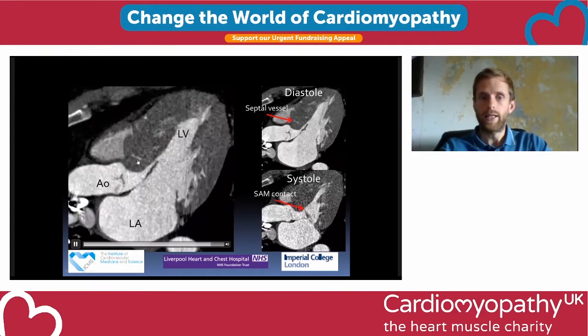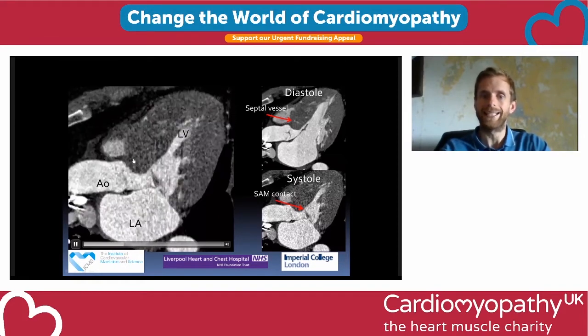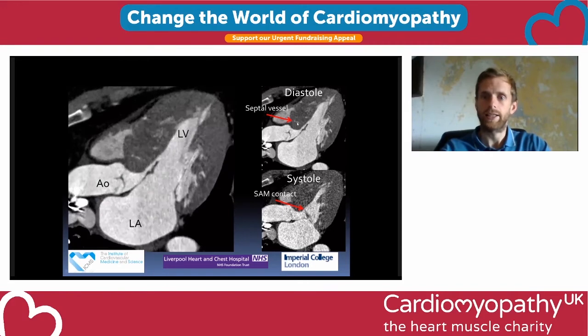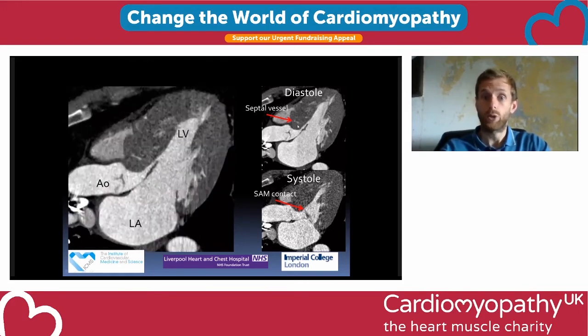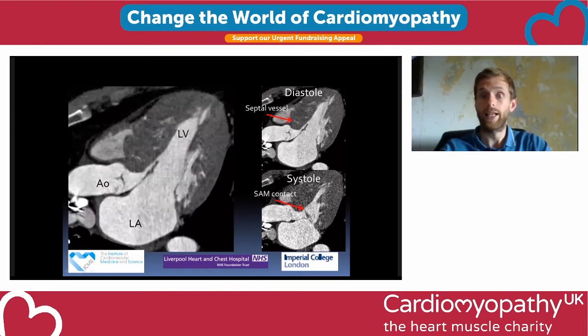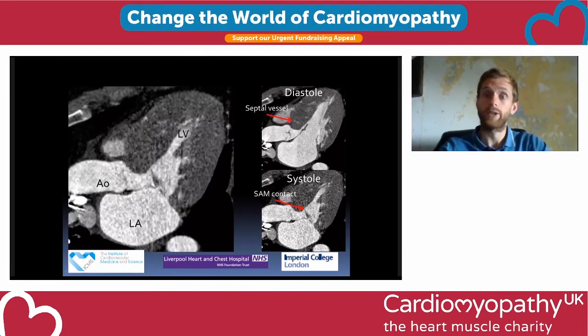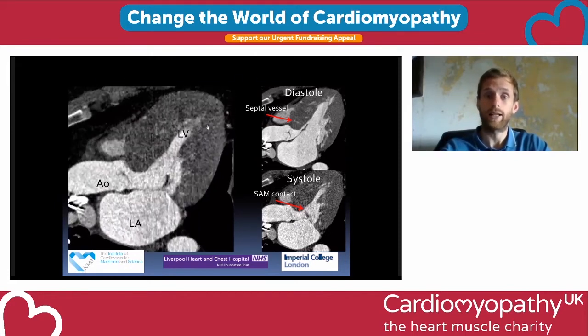Now, in this film, you see a flash of light grey here. This is blood inside a coronary artery. And this artery is going right to where we wanted to deliver the alcohol, therefore the damage. You see it highlighted in this freeze frame when the heart is relaxed. Okay. So we know that this is what we want to track, and we can then use computer tomography CT software to track this, to map it, and then know what we're going to face when we get into the cath lab.